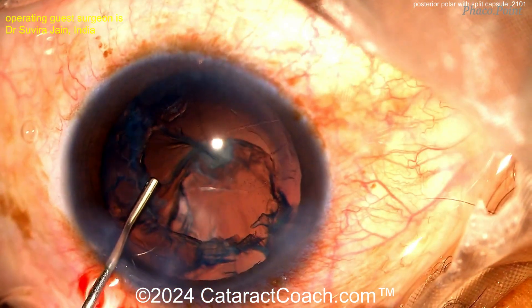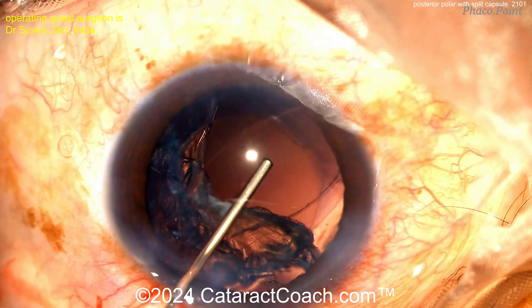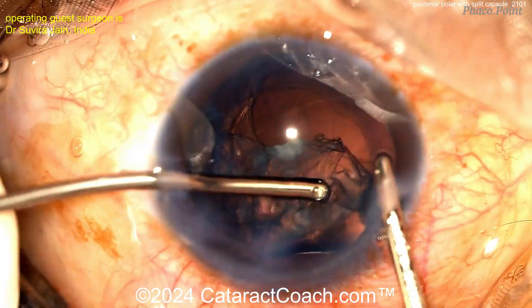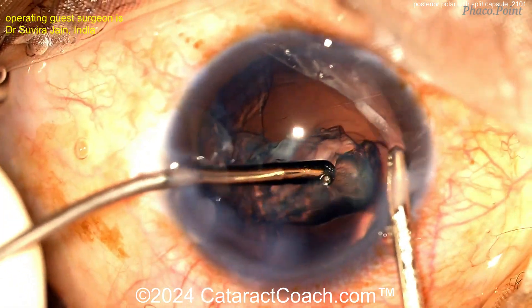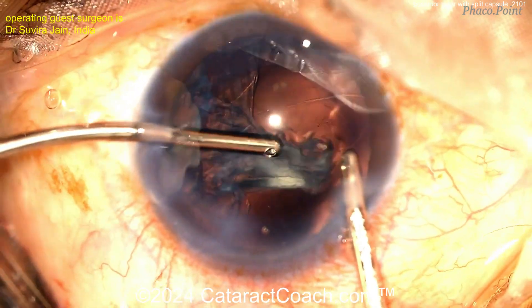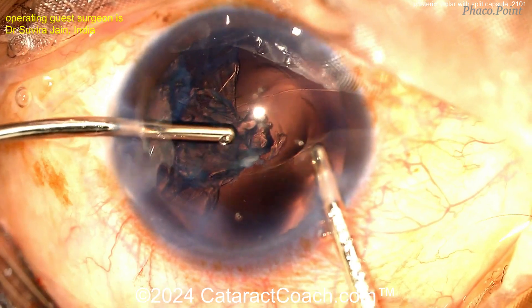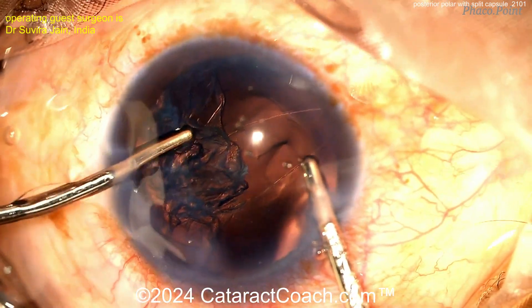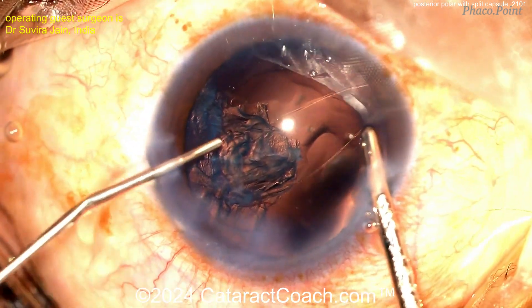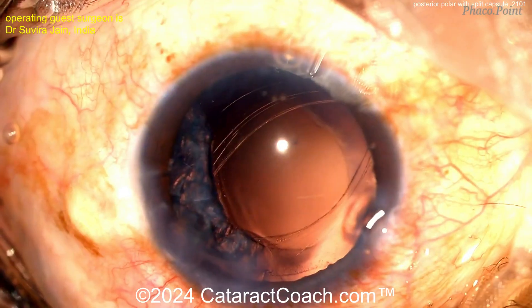Here we go. Remember, the capsule's open there posteriorly. So visco dissection — I like the technique here. Make sure it's a good dispersive agent. You want to peel off that cortex and epinucleus off of the capsule. Here with a bimanual IA approach, which is very helpful to get full access. And this entire time, remember, you want to keep the AC pressurized. You don't want to let the AC collapse or the AC pressure go to zero, because that may allow vitreous to prolapse forwards. You want to keep that anterior hyaloid face intact if you can. More viscoelastic — always a smart move.